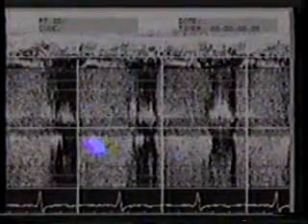The signal is holodiastolic, and the filled-in envelope indicates turbulence. The turbulent regurgitant flow is multidirectional, so we are able to easily detect it even from this parasternal vantage point, which is nearly perpendicular to the left ventricular outflow tract. The aortic regurgitant jet is characteristically high velocity, which results in aliasing in the pulsed mode.